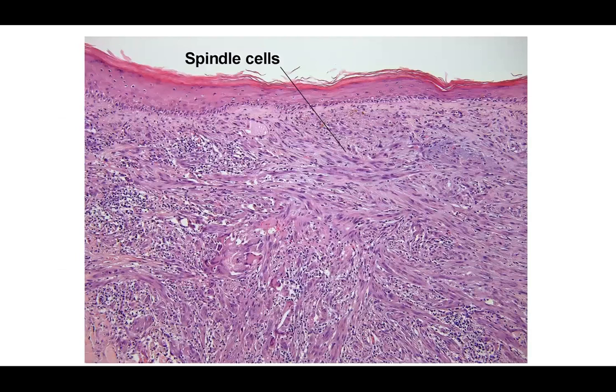So this is actually a better example of spindle cell or desmoplastic melanoma here, because you have a lot going on. But one thing that can make it tricky is you often have a lot of lymphocytes within the picture as well. So if you see lymphoid aggregates and you see a junctional melanocytic proliferation and you see a very busy spindle cell dermis, then doing your SOX10 stain will be vital to really clinch the diagnosis. You'll see contiguous growth along the junction in most cases, depending on the section, and you'll see diffuse infiltrative growth of atypical melanocytes.